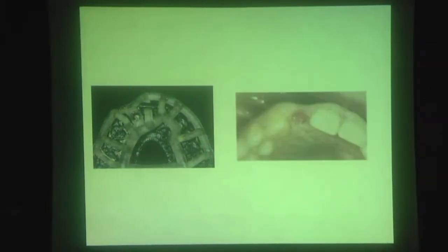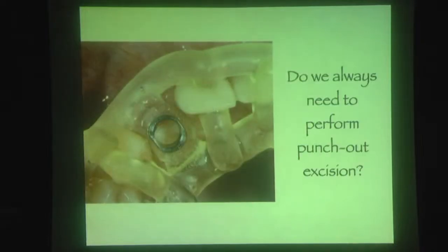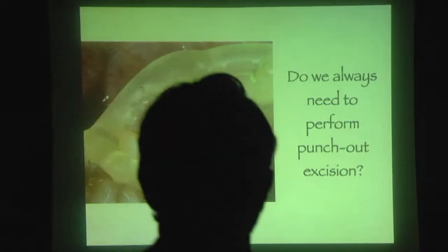And we produce the guide, and we place the guide. Here I have a question. Do we always need to perform punch-out excision? No, it is okay. Why? Do we always need to perform punch-out excision?